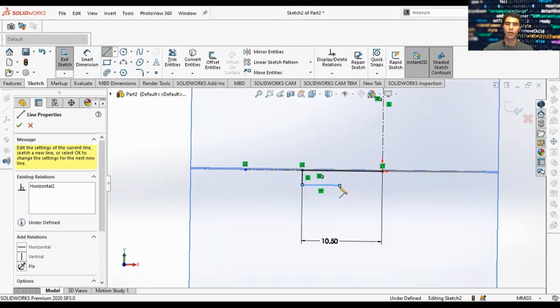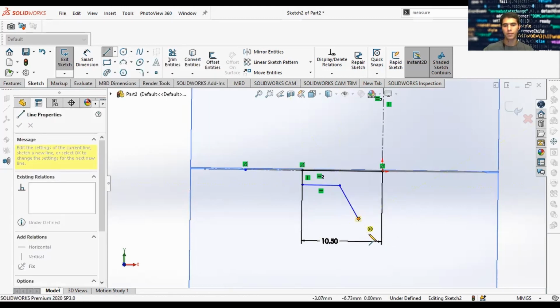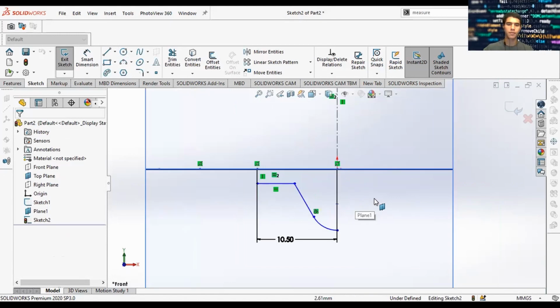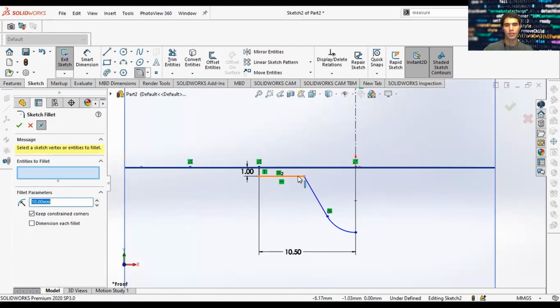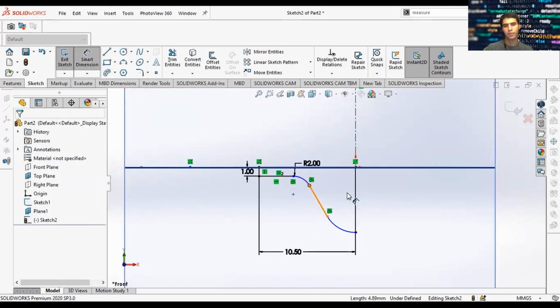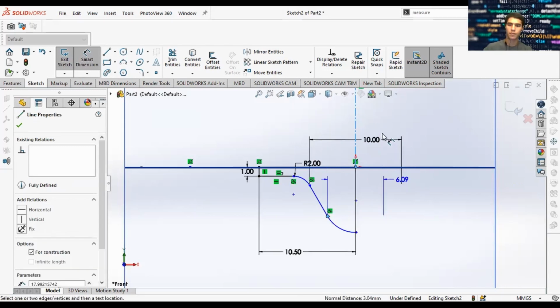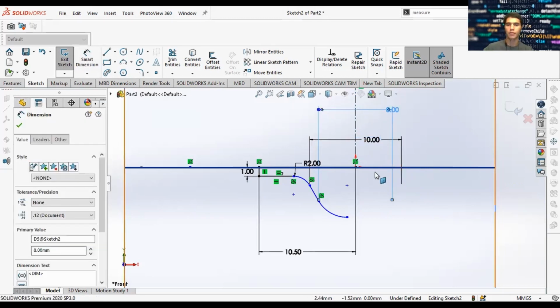If you look at it from the side, back to our PowerPoint, it kind of looks like this from the side. So now we're just going to add some dimensions to it. Let's fillet this. Let's move this in space.